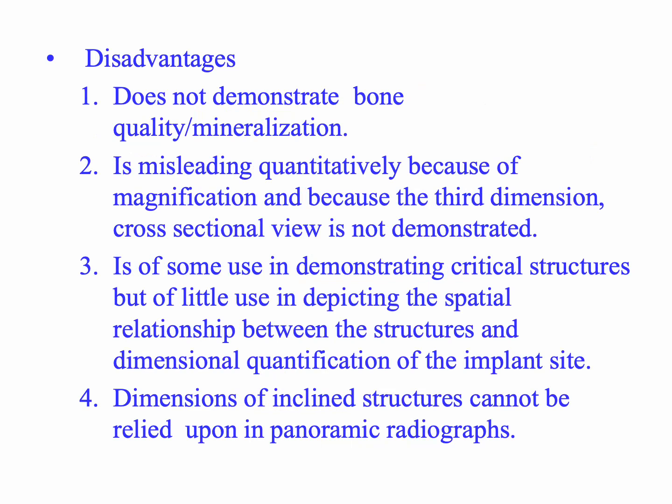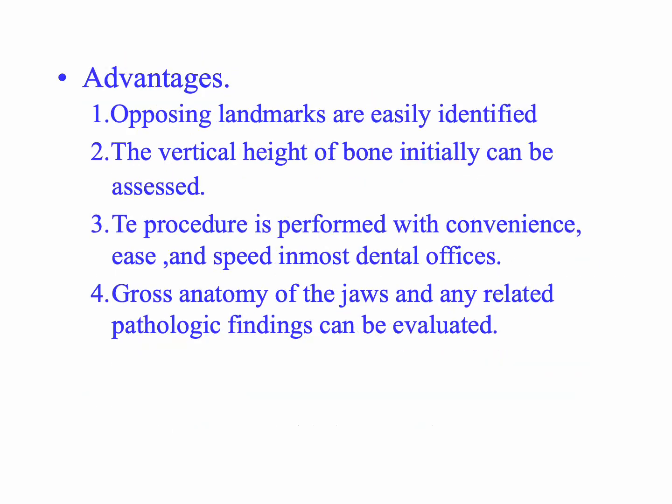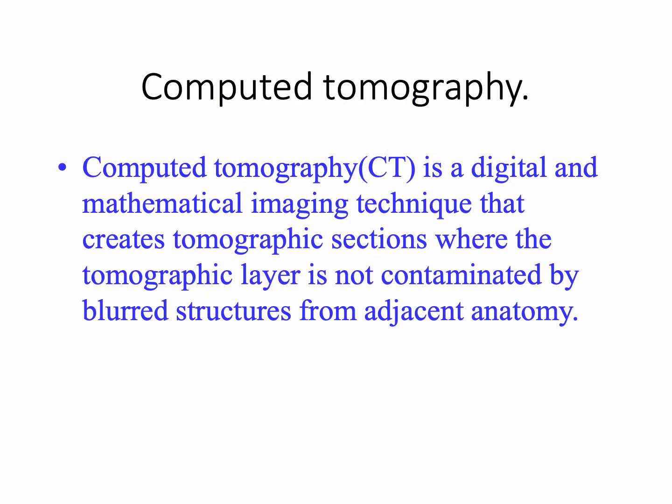The limitations are that it does not demonstrate bone quality or mineralization of the bone. It can be misleading because of magnification. It is of some use in demonstrating critical structures, and the dimensions of inclined structures cannot be relied upon with OPG. The advantages, however, are that it can be used when opposing landmarks are easily identified. The vertical height of bone initially can be assessed with this. The procedure is performed with convenience, ease, and less cost compared to CT.